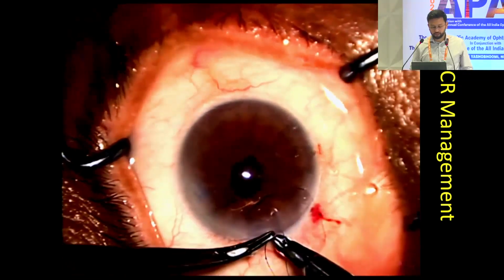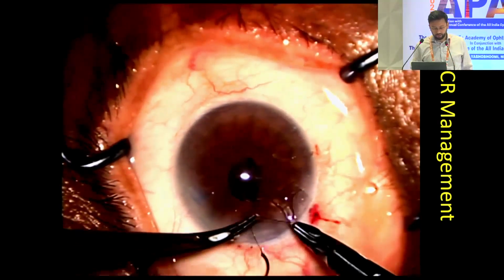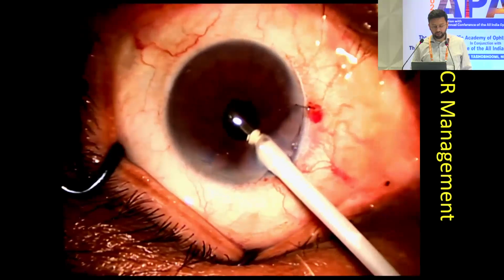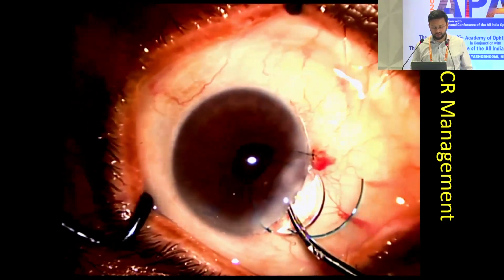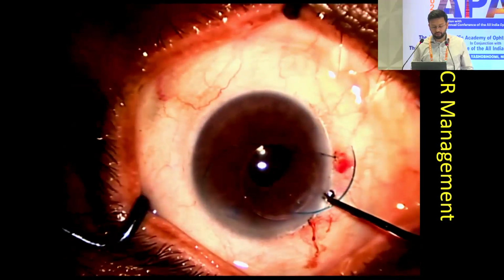Then with partial closure of the incision, following which we started anterior vitrectomy, ensured there are no vitreous strands in the AC. And then we implanted a 3-piece IOL.